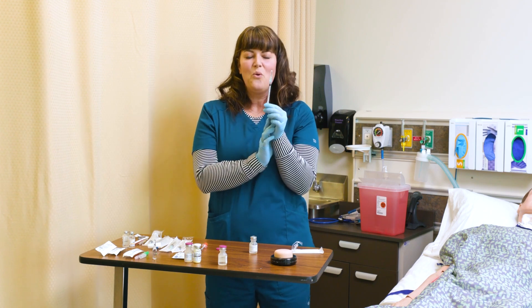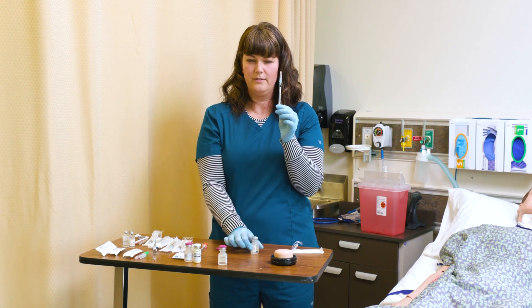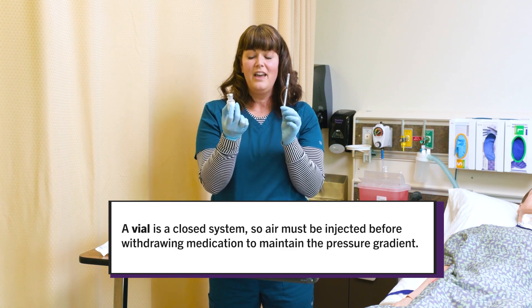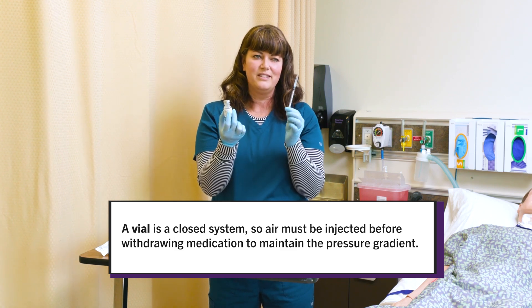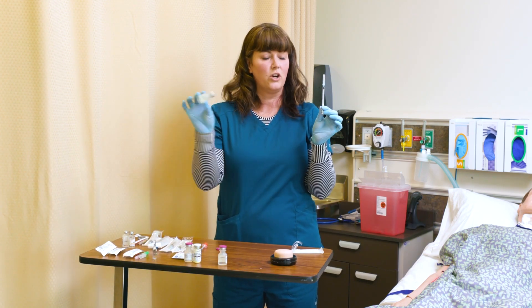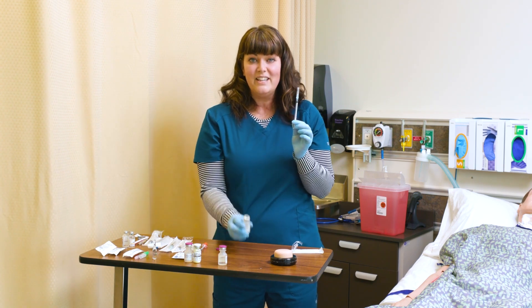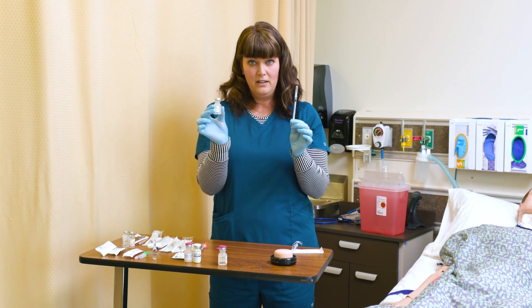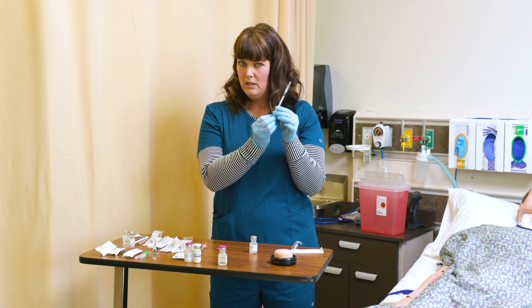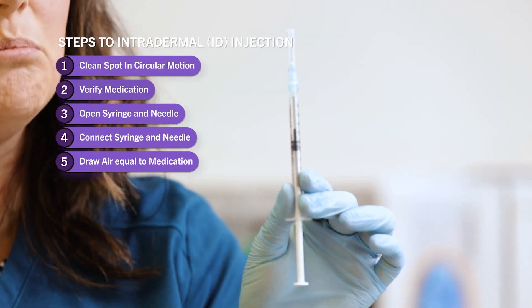One thing to understand is the pressure of syringes versus the pressure of vials. I need to keep the pressure inside this vial the same. This decreases bubbles in the solution when you draw it up, and also prevents medication from squirting out when you pull the needle out. So remember: any quantity of fluid I remove from this vial, I need to replace with air. If I need 0.5 milliliters of fluid, I draw up 0.5 milliliters of air first.